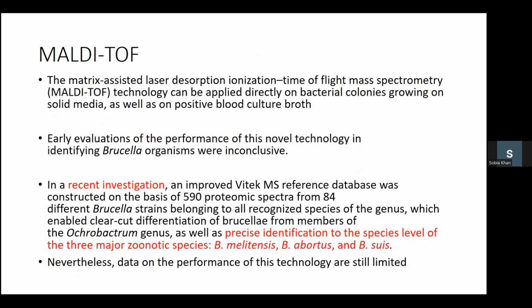Then moving on to MALDI-TOF, any automated system is as good as its database. So initially, MALDI-TOF results were inconclusive. However, in recent investigations, MALDI-TOF was able to differentiate and identify to species level Brucella melitensis, abortus, and suis. However, it could not detect Brucella canis. Nevertheless, the data on performance of this technology are still limited, and we need more improved systems for this.